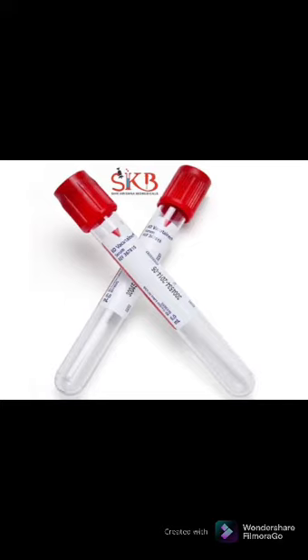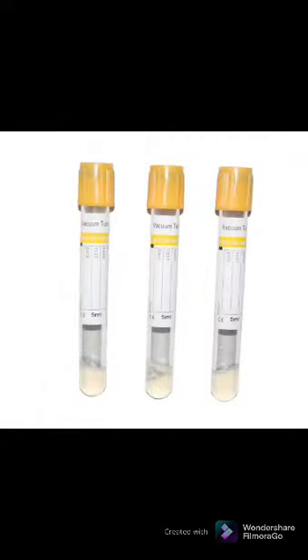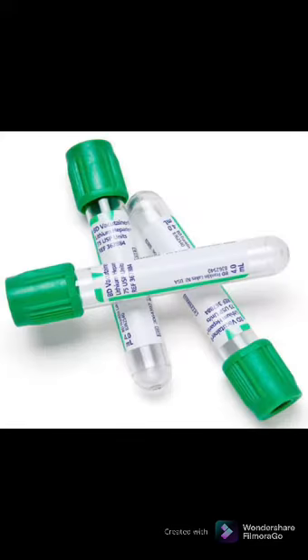Third, we have the red top tube that has no additive, and it is found in the blood bank department. Then we have the gold top tube that has the clot activator additive, and the function of that additive is to promote blood clotting with glass or silica particles. Gel separates serum from cells, and that is found in the chemistry department. Then we have the green top tube that contains heparin additive, and the function of the heparin additive, it prevents clotting by inhibiting thrombin and thromboplastin, and it is found in the chemistry department.